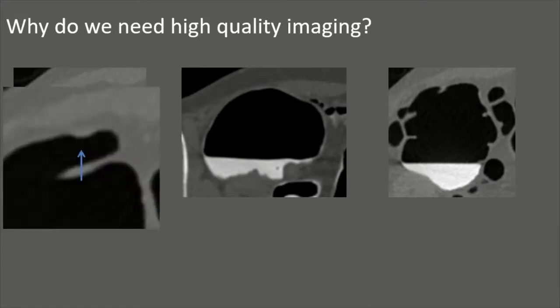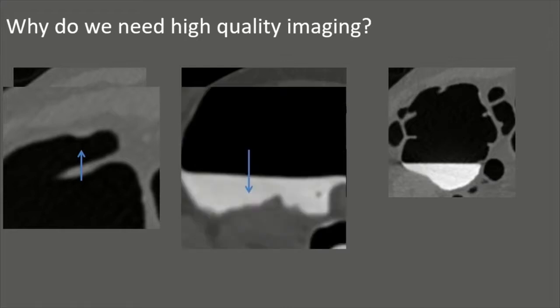First case, there's a minimally elevated lesion just on the anterior surface of the bowel wall, which would be very hard to see if you didn't have good distension. This case here in the middle, there's some irregularity on the posterior side of the wall, and again, if there was poor distension, this would be easily missed or mimicked by areas of poor distension. And also, I think this highlights the fact that you need good fecal tagging and bowel cleansing, because untagged feces would also mimic this.